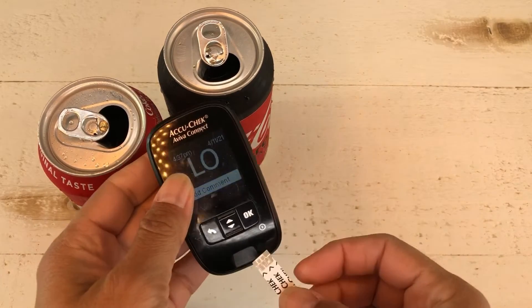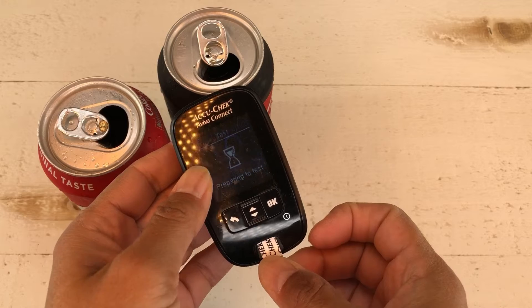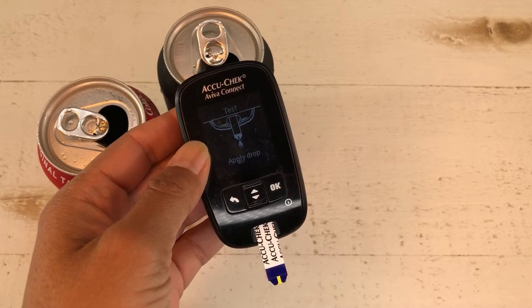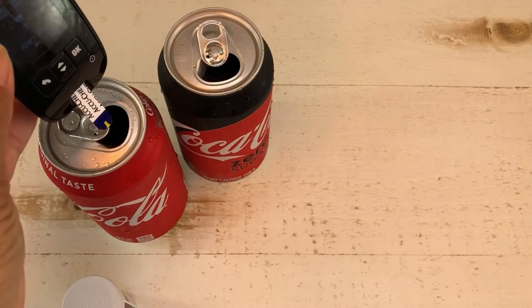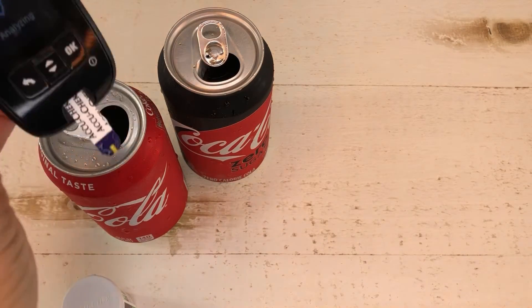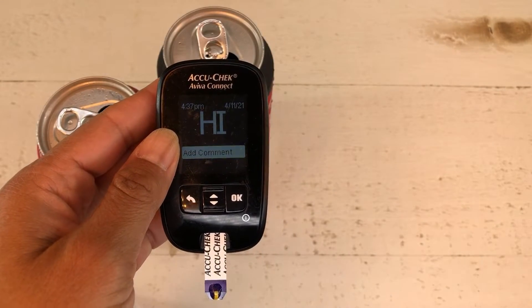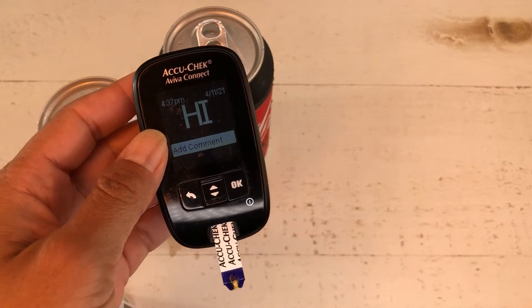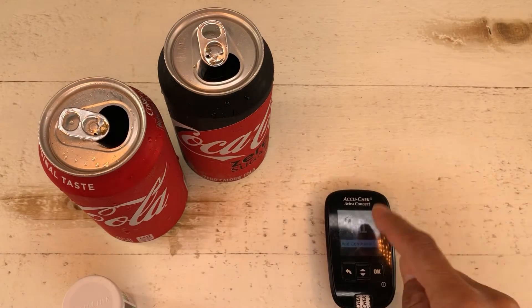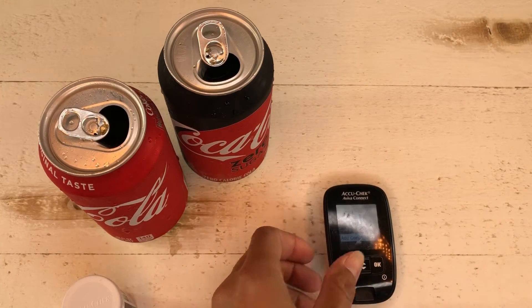Now we want to test the regular sugar drink and see what that says. Preparing to test - apply drop - I just stick it into the soda. Analyzing... HIGH. That simply means it's high because there's a lot of sugar in that. So there you go - the AccuChek meter definitely works for that. Let's try one of the other meters.